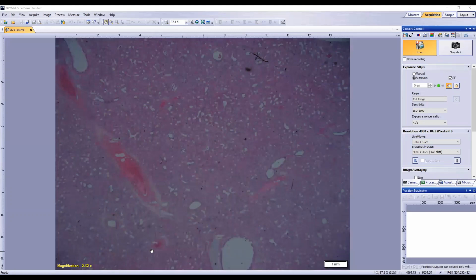If we've got lytic necrosis going on, then what else are we going to have mixed in with the degenerate neutrophils and the amorphous eosinophilic material? Cellular debris, yep. The nuclear debris is going to be mixed in with the fibrin and all the pink stuff.